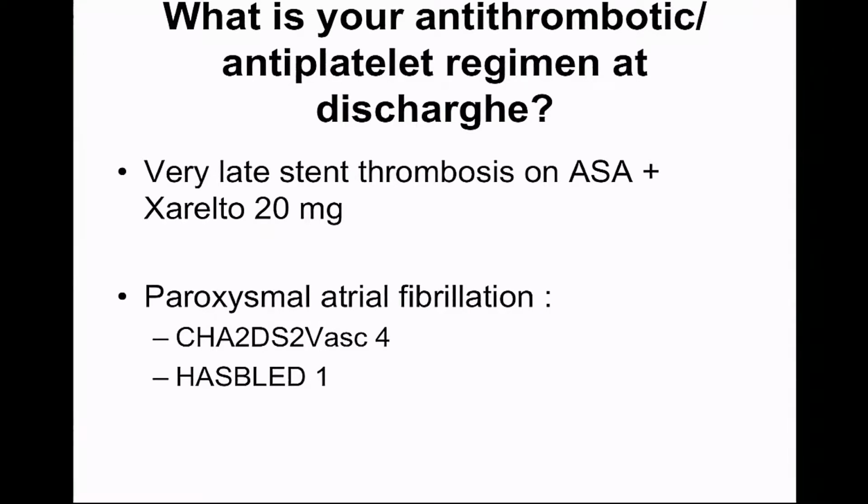About 1 or 2 hours of chest pain. Okay, and how early was this echo done? Do you expect some of it to recuperate, or is it fixed and you have 5,000 of CKs? This is a day 2 cardiac ultrasound that was performed after the PCI. So fairly early. Yeah.